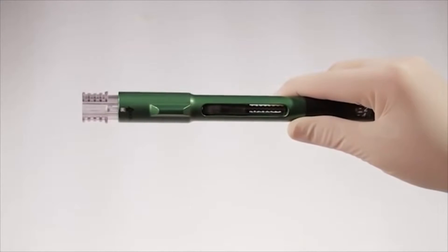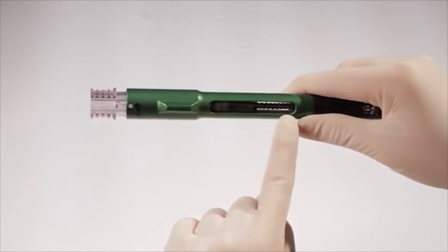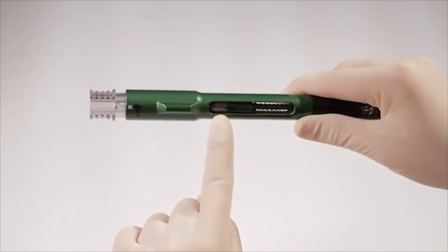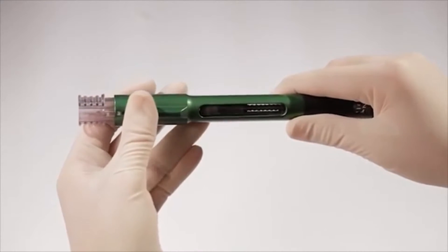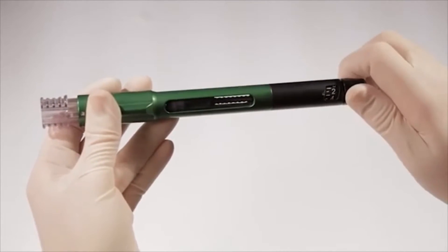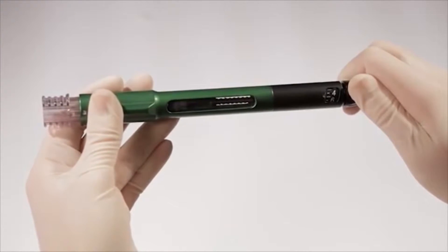To determine when to change the 3-milliliter cartridge, check the pen's chamber window. When the plunger of the 3-milliliter cartridge reaches the bottom of the cartridge chamber, the 3-milliliter cartridge is empty and needs to be replaced. Another indication that it needs to be replaced is if the volume dial will not dial to the desired amount of solution to be mixed.